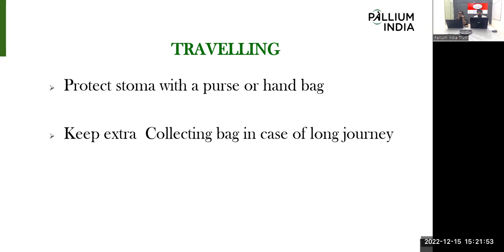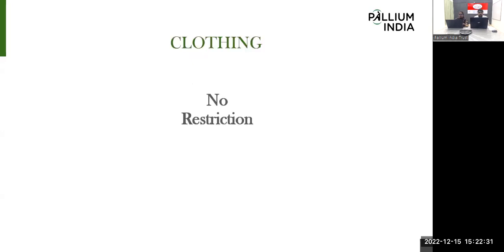Maybe during traveling time, accidentally they take another type of food item. Maybe the bowel movement is a little bit rapid, and due to the rapid movement, fecal matter may come in between. In their calculation, they expect the bag to fill only this much within this time limit. But due to the journey, the bag filling time will vary. So according to the bag filling time, they need to empty it, and they need to carry an extra bag while traveling.